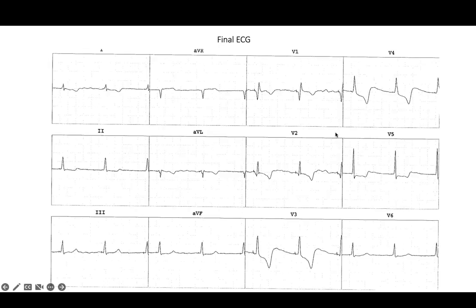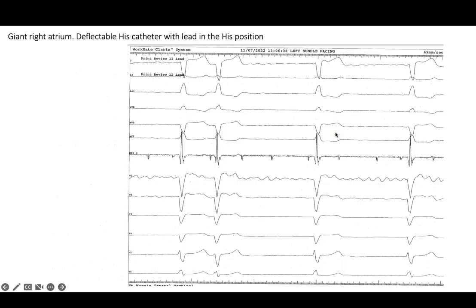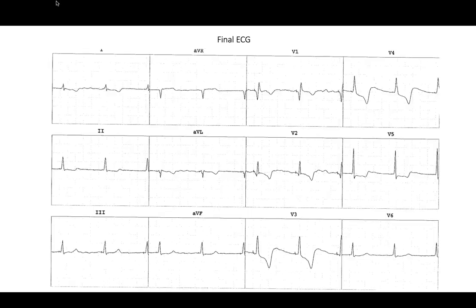And this is somebody with this sort of ugly-looking ECG. So it doesn't preclude you from getting a good result. It's just a nice picture, of which we don't see very often. And the next one is the paced one. Beautiful. A nice result, surprisingly.